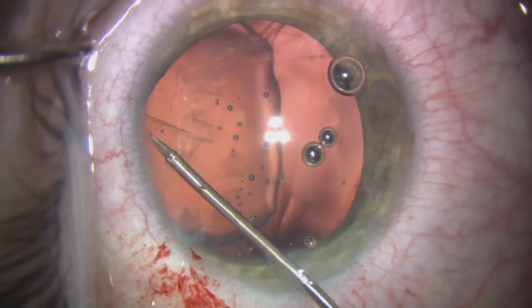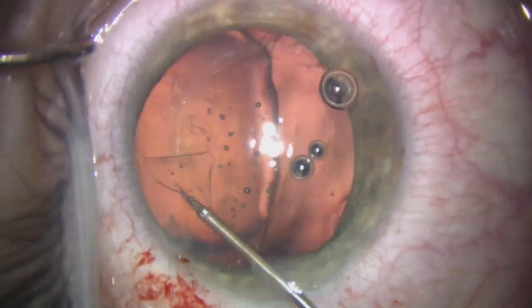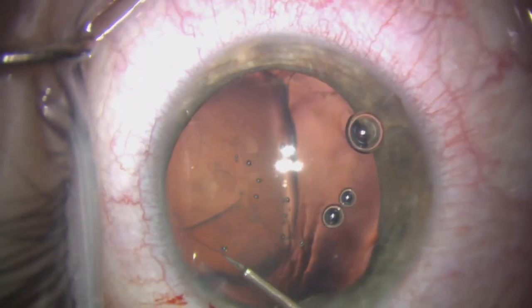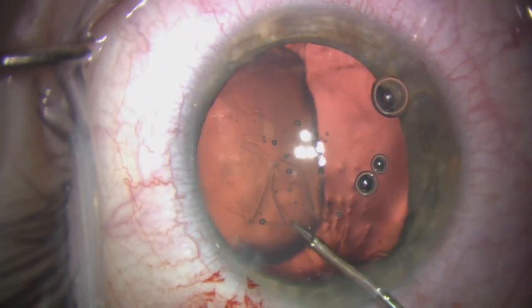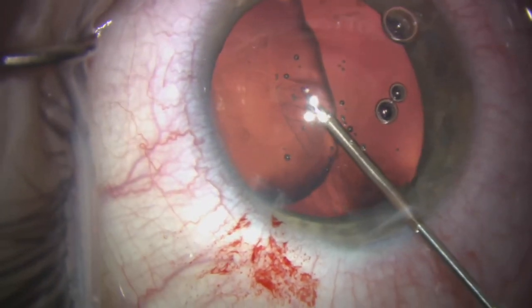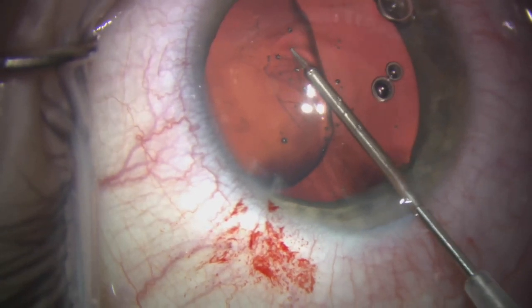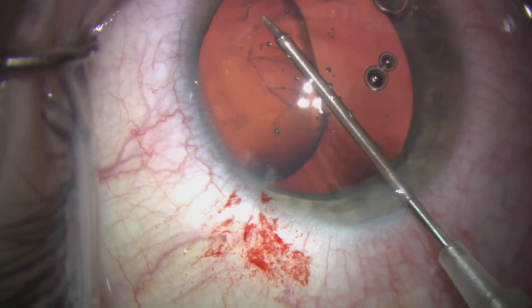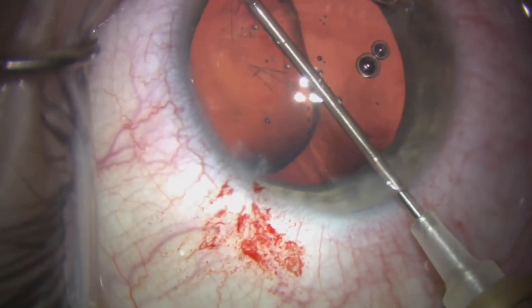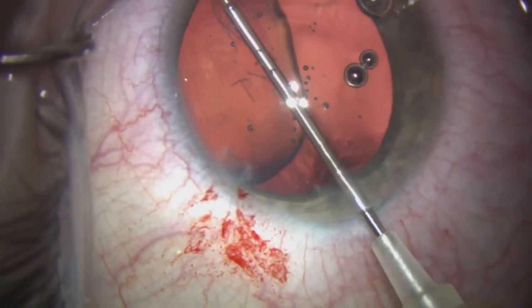It's very important to be mindful that this is a very young patient with an elastic capsule, so the risk of run-out is also somewhat increased. The Helon 5, by flattening the capsule, helps to reduce this risk. Nevertheless, the rhexis needs to be performed in a cautious manner, because a tear-out here can really mean the difference between getting a lens in the bag and having to perform scleral fixation, which is not ideal in a case like this.